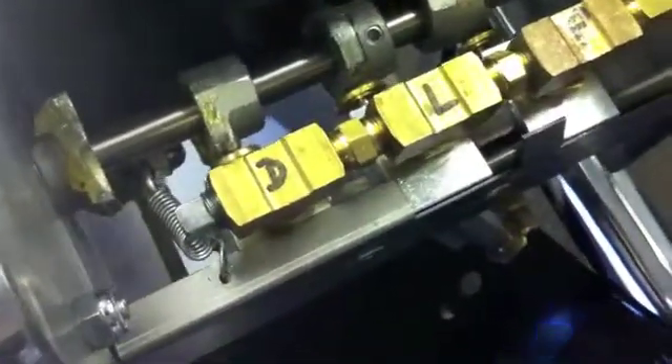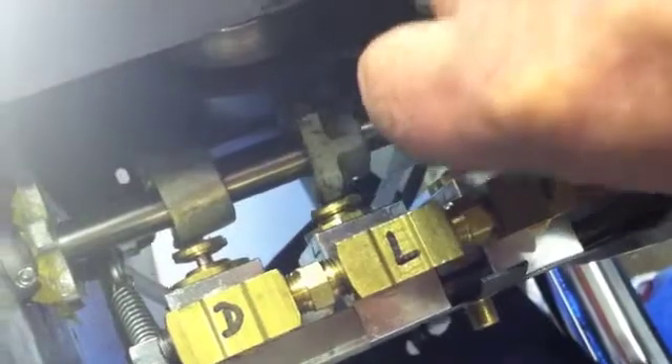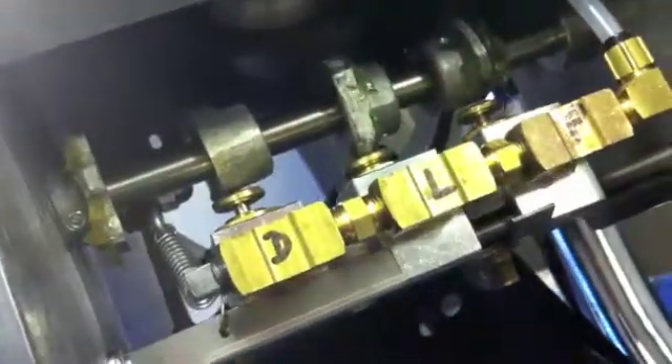Next we move to the lumbar setting. At lumbar, the dorsal valve is closed, the lumbar valve is now open, and the pelvic valve is closed. We verify the closed valves with the feeler gauge: the pelvic gauge goes through freely, the lumbar feeler gauge will not fit — that valve is open — and the dorsal feeler gauge goes through, confirming that valve is closed.